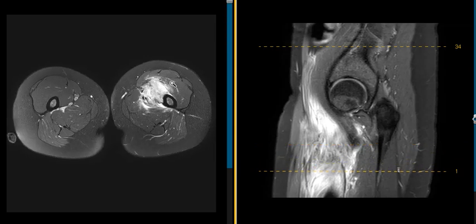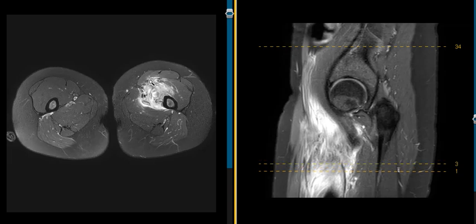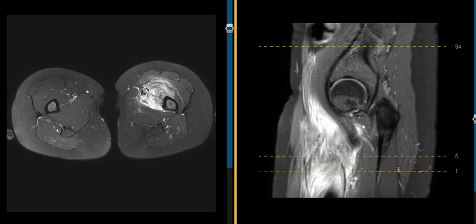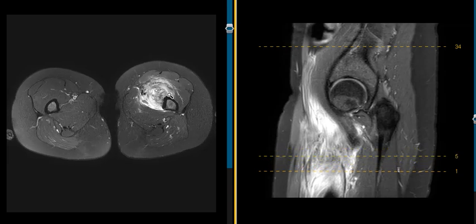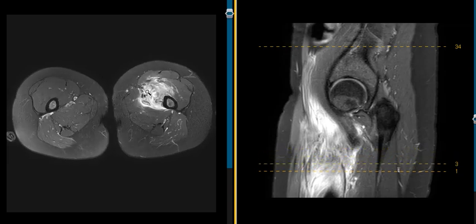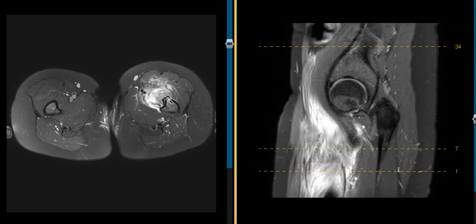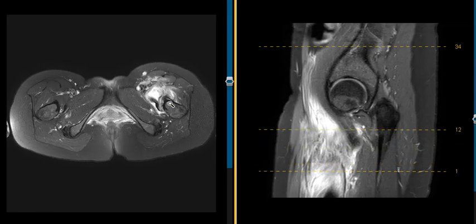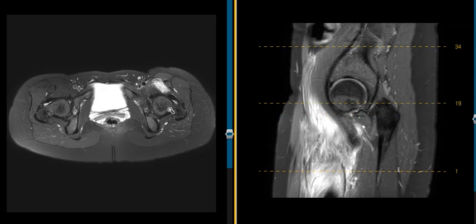She has a large area of abnormal signal, heterogeneous with surrounding edema in the anterior upper thigh muscles here, and at first glance we worry about a sarcoma.